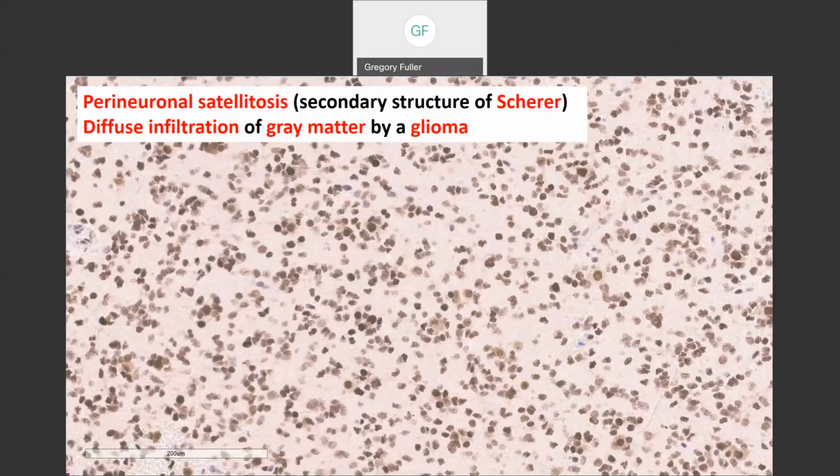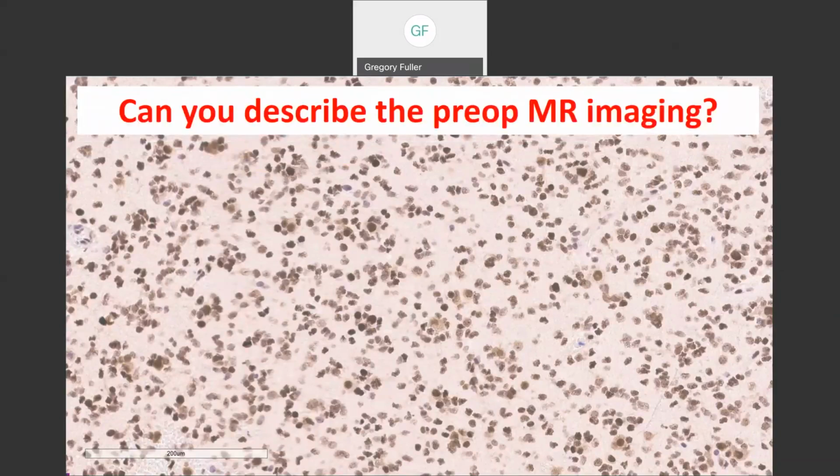Now look, the first point of this slide is you do not have to have an H&E slide to recognize basic H&E pathology, basic processes. This is an immunostain. I could have shown you a stone cold negative, hematoxylin only, negative immunostain, or a control for an immunostain with just hematoxylin, and you should be able to see the satellitosis, right? And pick up that that's what's going on. Think outside the box. You can't be so limited that you only recognize a thing in one of its manifestations, right? All right, and you can develop that ability. All right, what's the pre-op imaging look like of this area?